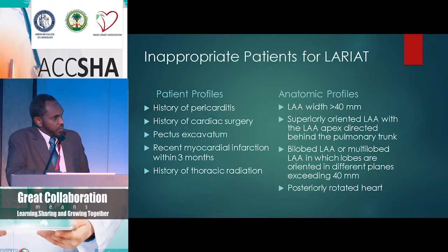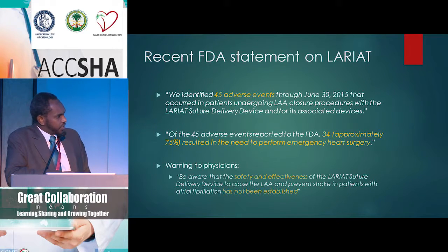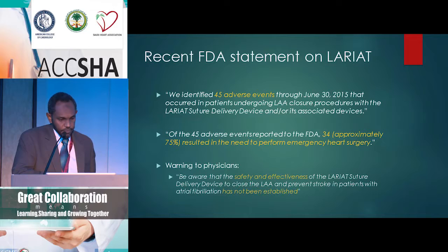There's a recent warning from the FDA that came out, I think, last July regarding this device, saying that there have been 45 adverse events reported through June 2015, and 34 of those, meaning approximately 75%, resulted in the need for emergency heart surgery. That's a high percentage. So there's a warning to the physician that safety and efficacy of the LARIAT has not been established in patients who have non-valvular AFib.